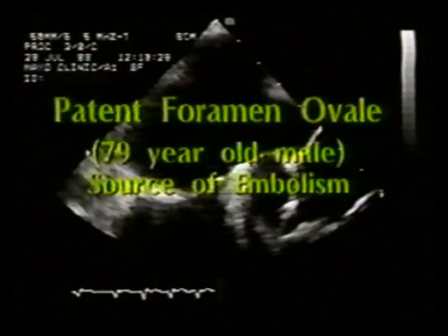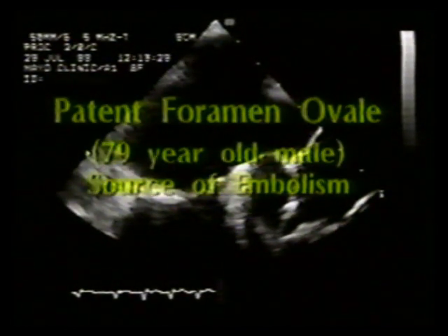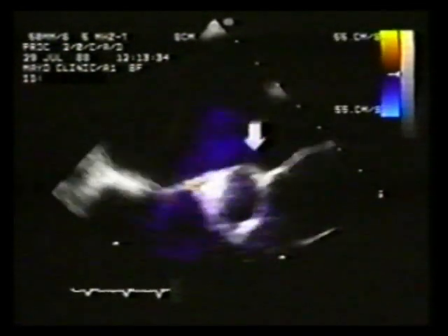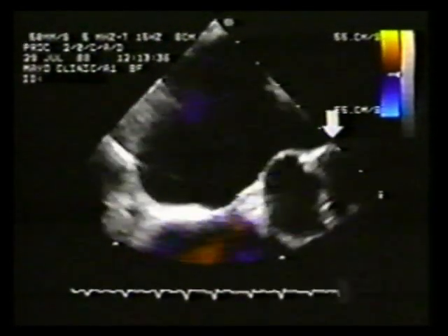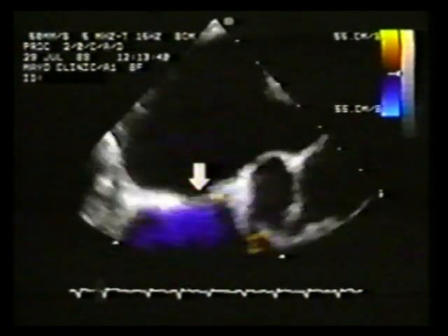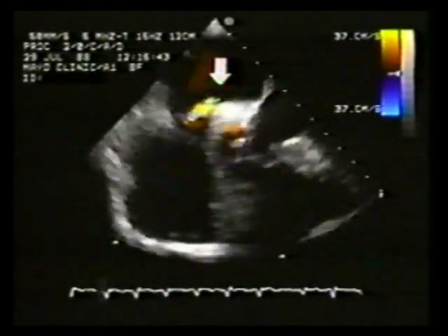The next unique application of transesophageal echocardiography is identification of the patent foramen ovale for source of embolism. This is a frontal four-chamber view with visualization of the left ventricular outflow tract, portions of the mitral valve, and the atrial septum. Note in the membranous portion of the atrial septum with color flow Doppler, there is turbulence within the valve of the fossa ovalis.